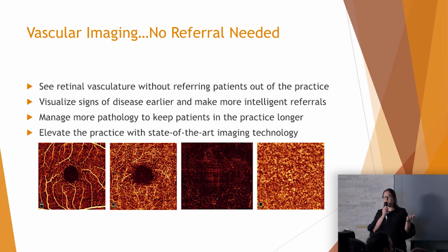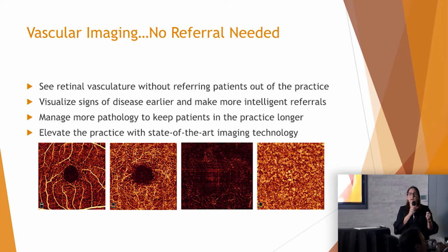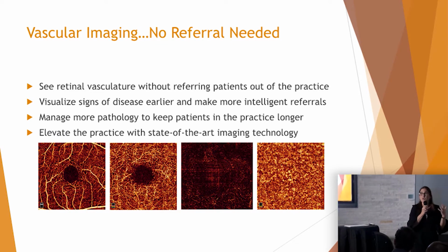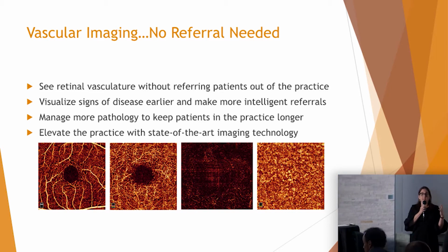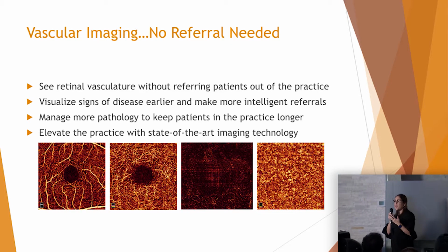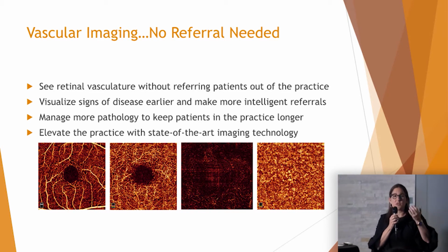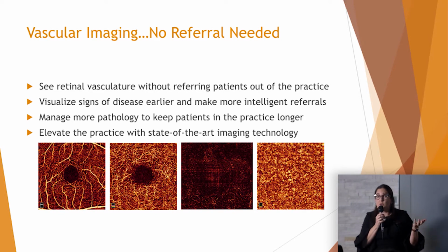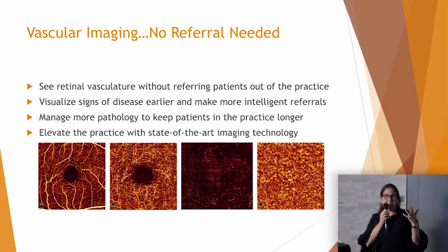What about diabetes, right? I think that Craig talked before about how this OCTA technology is showing us evidence of disease so much earlier than on fundoscopic examination. This is going to allow us to take better care of our patients, right? We're going to have better communication with the internist. We're going to have better communication with the patient. These patients might think they're doing phenomenally well, and the OCTA is giving us information that we didn't see before, okay? So this is giving us just awesome, awesome information.